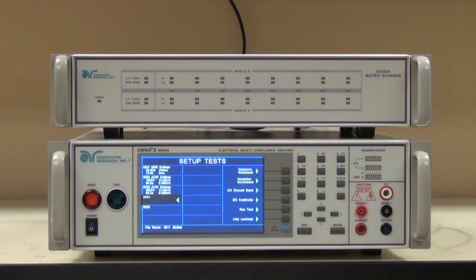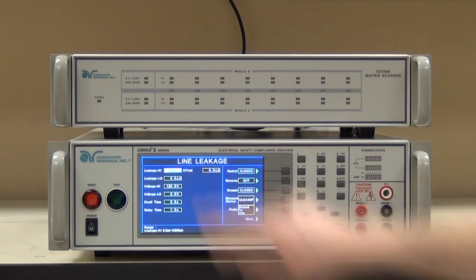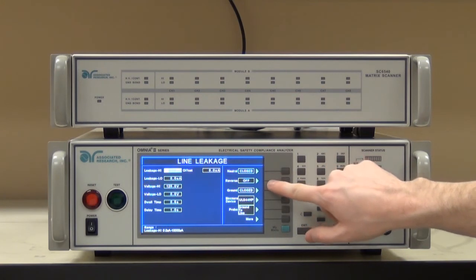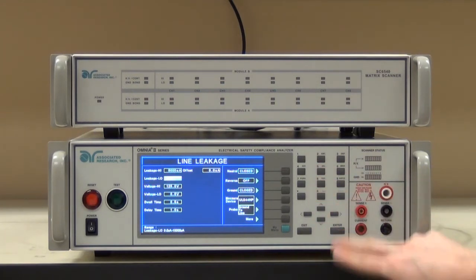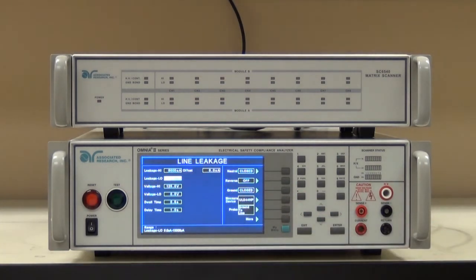First, let's start with the earth leakage test. I need to set my parameters to match up with the 60601 standard. I'm going to start with normal conditions, which means a closed ground, normal polarity — reverse off, and closed ground. Per the 60601 standard, the leakage high limit for normal conditions is 5,000 microamps. I'm going to leave leakage low alone for now, and I'm also going to give myself a voltage window. Per the 60601 standard, I need to run the product at 110% mains voltage. Since I'm dealing with a 120 volt product, I'm going to be driving it with 132 volts. As a result, I want to set a window to make sure I don't go too far outside the 132 volt mark.